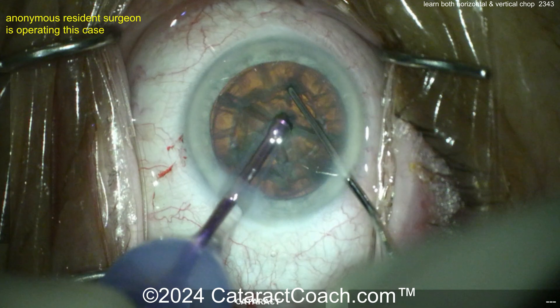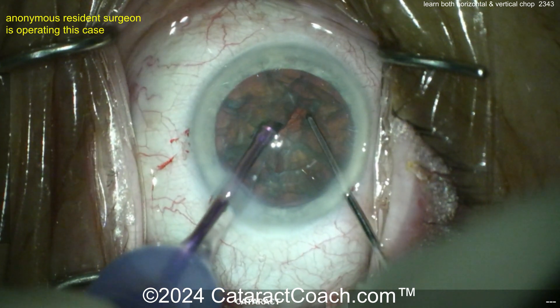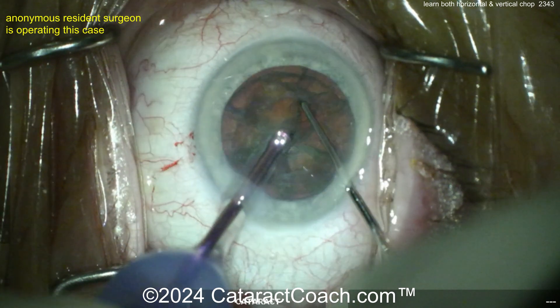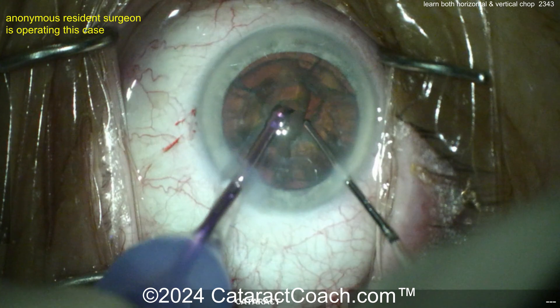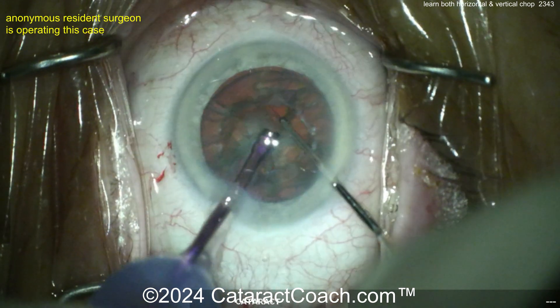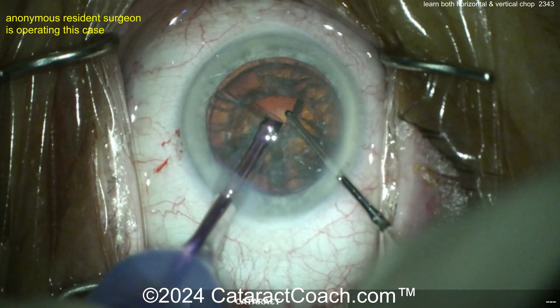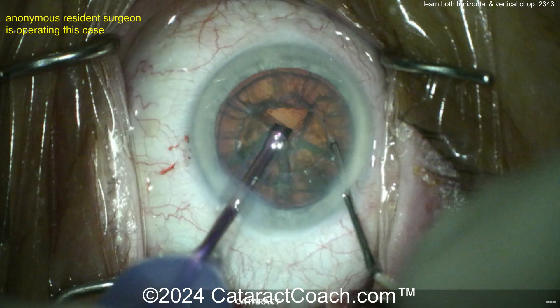So here we go — FACO probe embedding it. Embed, and you're listening for the audio cues. You're listening for your machine to hear the vacuum valve go up — that means chop right there. So vacuum's high, chop. But if you hear it come back down, now you've lost your purchase, you've lost your holding power, it's hard to chop it.